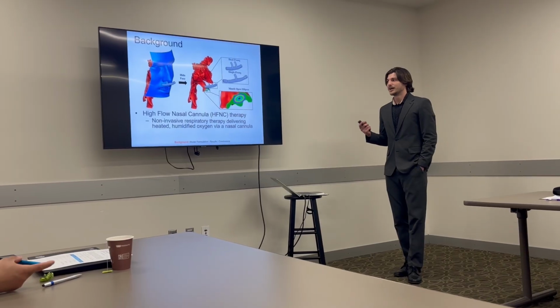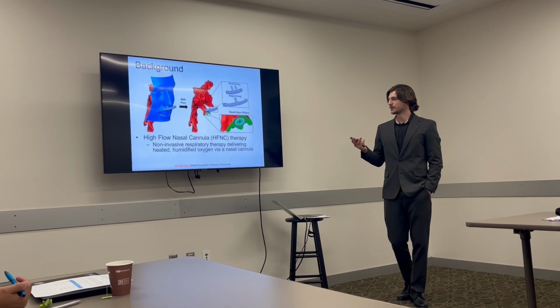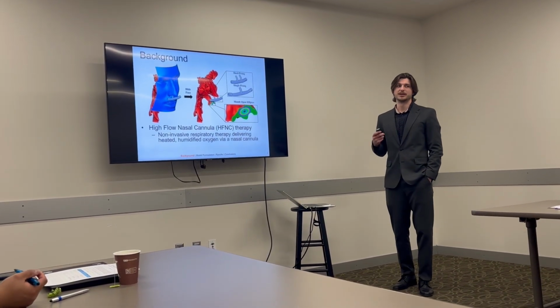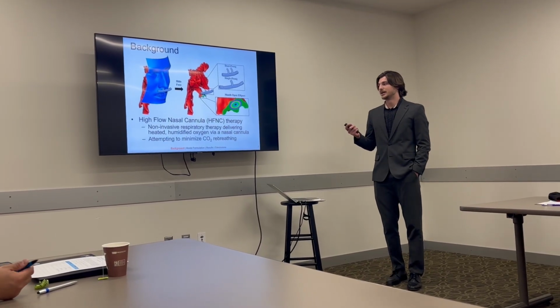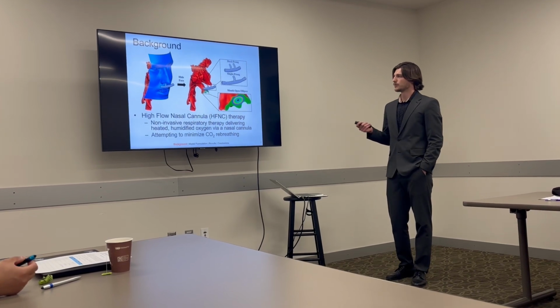So this is a modality in which respiratory therapy is delivered via a nasal cannula. This is heated and humidified oxygen specifically. And we're attempting to minimize CO2 rebreathing in the domain here. So just a quick overview of the domain.